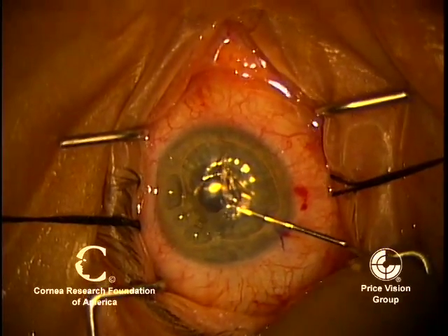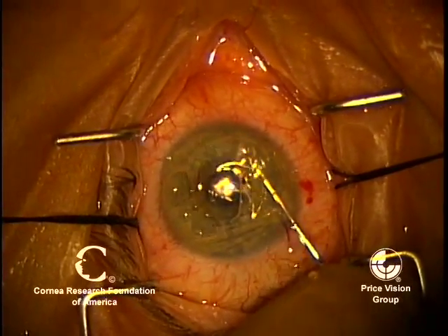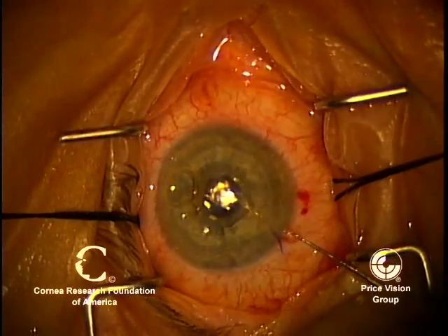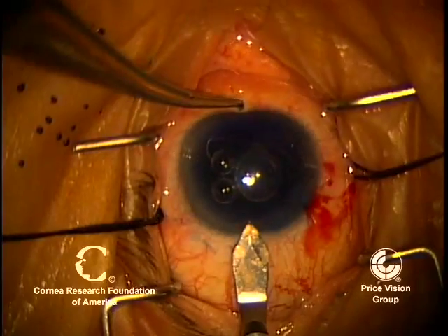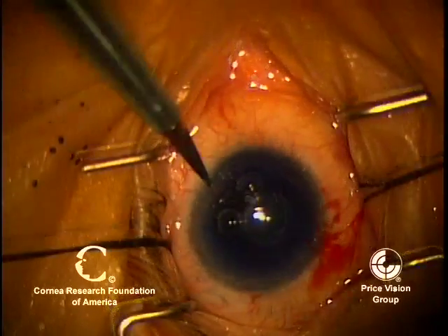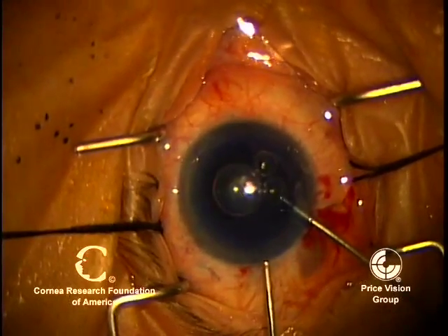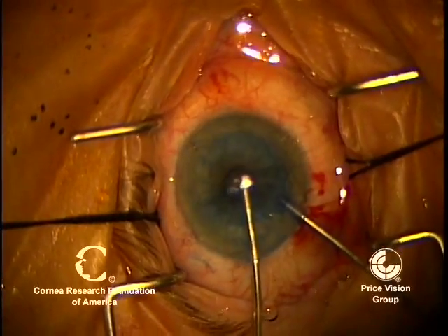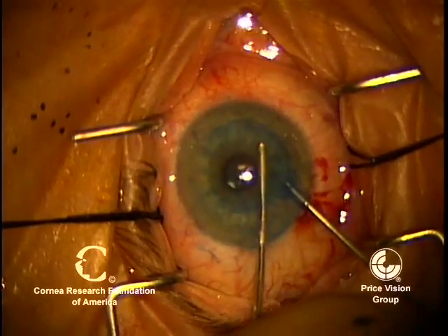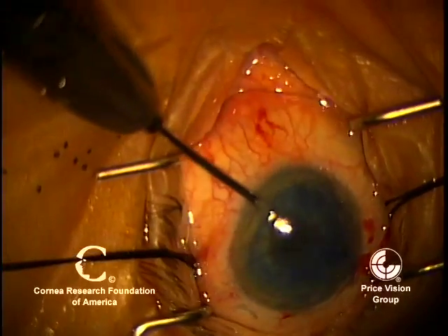We pull off the Descemet's membrane, which has the guttata. After removing Descemet's, I like to put in trypan blue or Vision Blue. That will stain all the areas that may have loose tags of Descemet's so that we can remove them now. This is a bimanual I/A where we're taking out the excess air. We're now going to go around with the aspiration tip and remove loose tags of Descemet's.